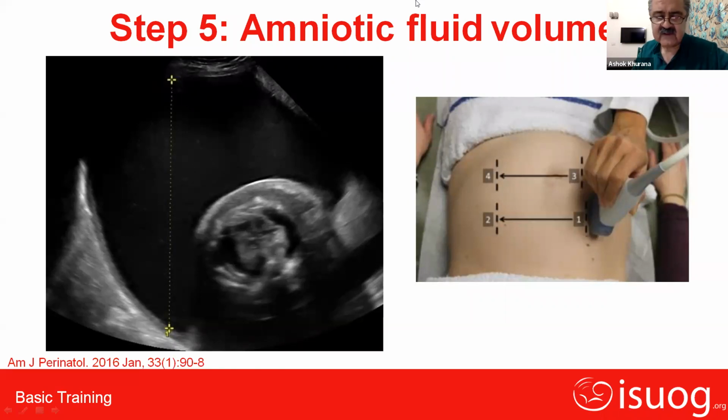In the first trimester, we usually try and see what is the amount of amniotic fluid compared to the space occupied by the fetus. And as long as you can fit one more fetus into that uterus, you know that amniotic fluid volume is normal. If you cannot fit one more fetus into that uterus, that amniotic fluid index is low. And if you can fit in more than 2 fetuses, that again would be a polyhydramnios. So in the first trimester, we don't really like to use an amniotic fluid index, but in the second and the third, it is worth quantifying just as Dr. Ajit has taught us.